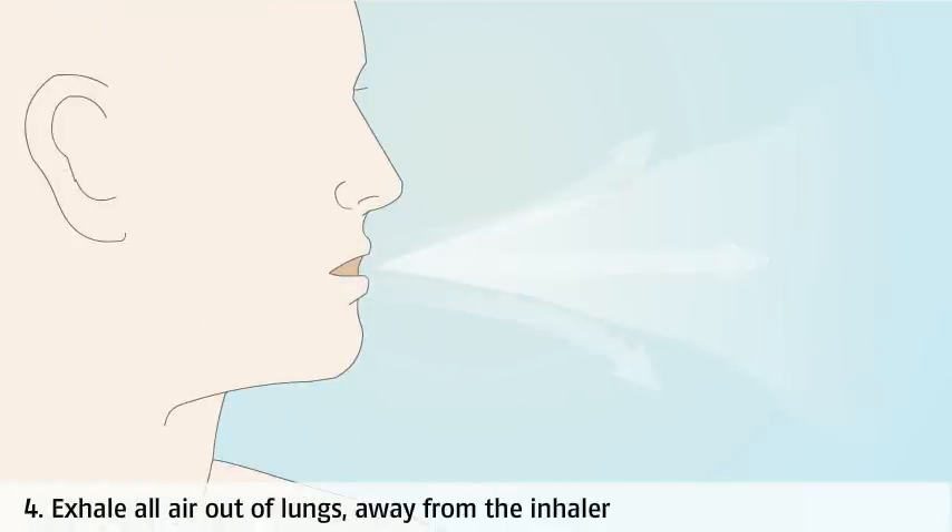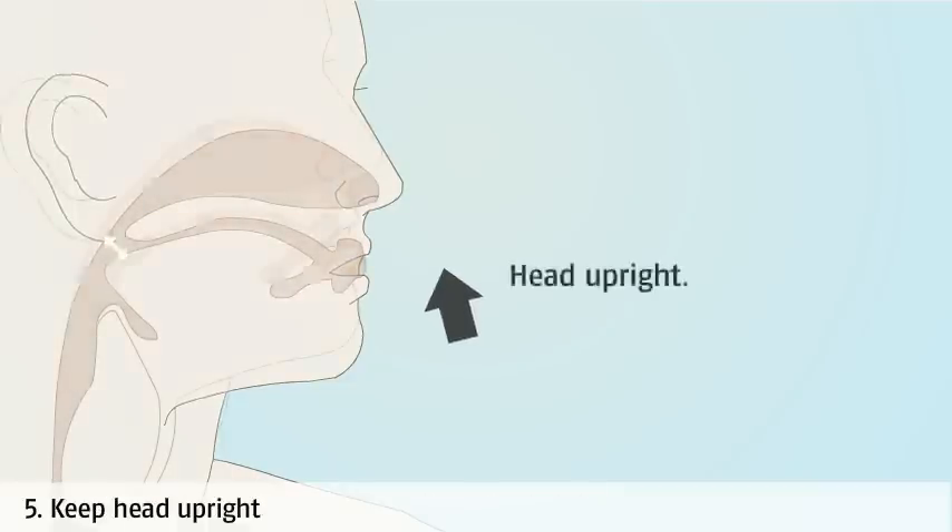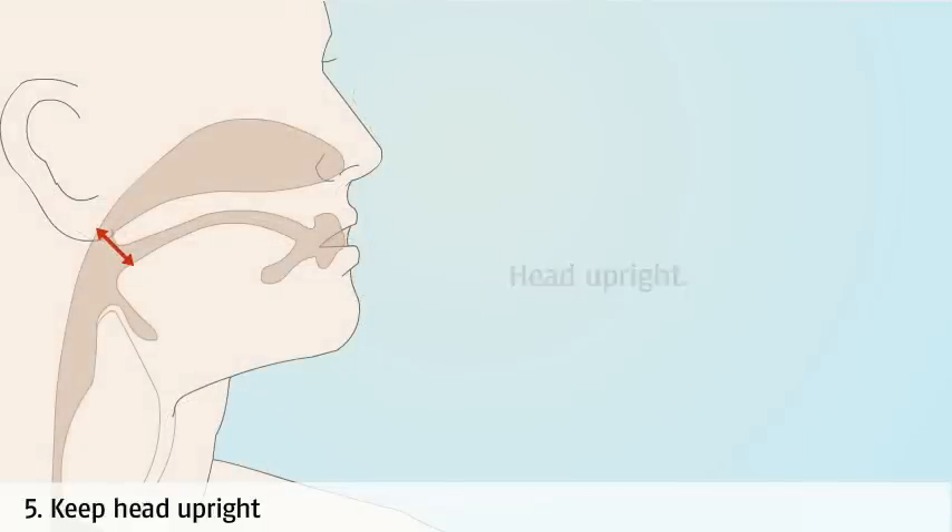Breathe out fully before inhaling the dose, making sure you breathe away from the mouthpiece. Keep your head upright and lift your chin slightly. If your chin is tilted down, the medicine will enter your mouth and throat rather than your lungs.